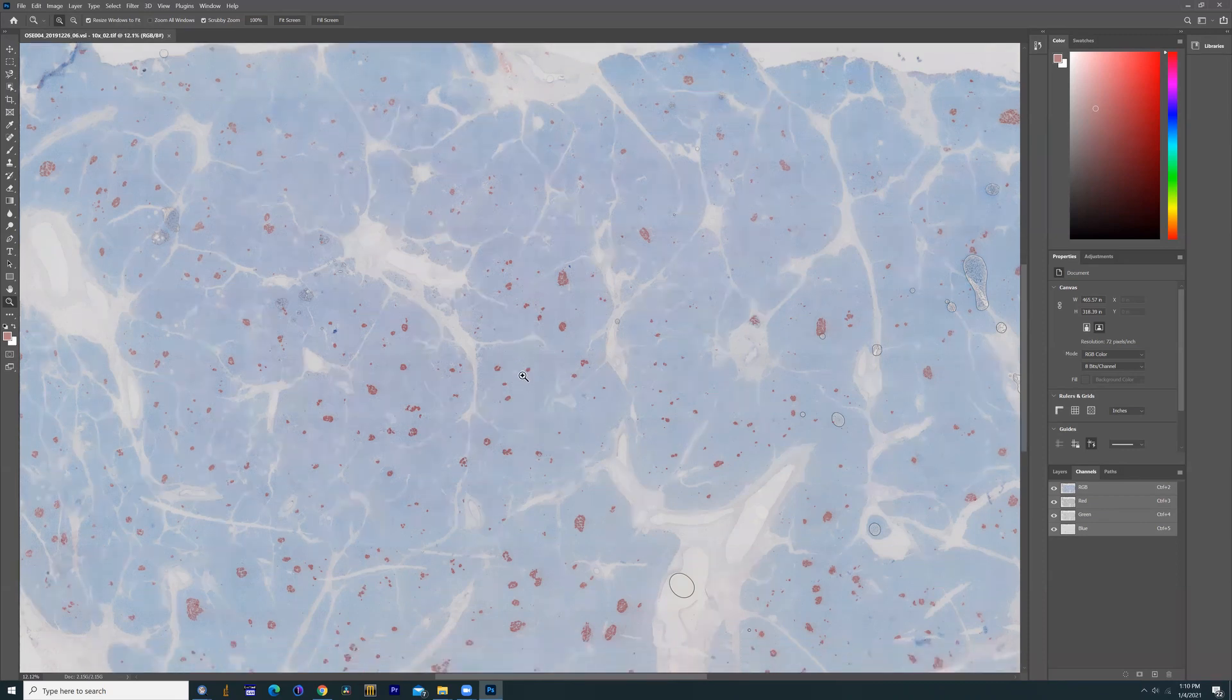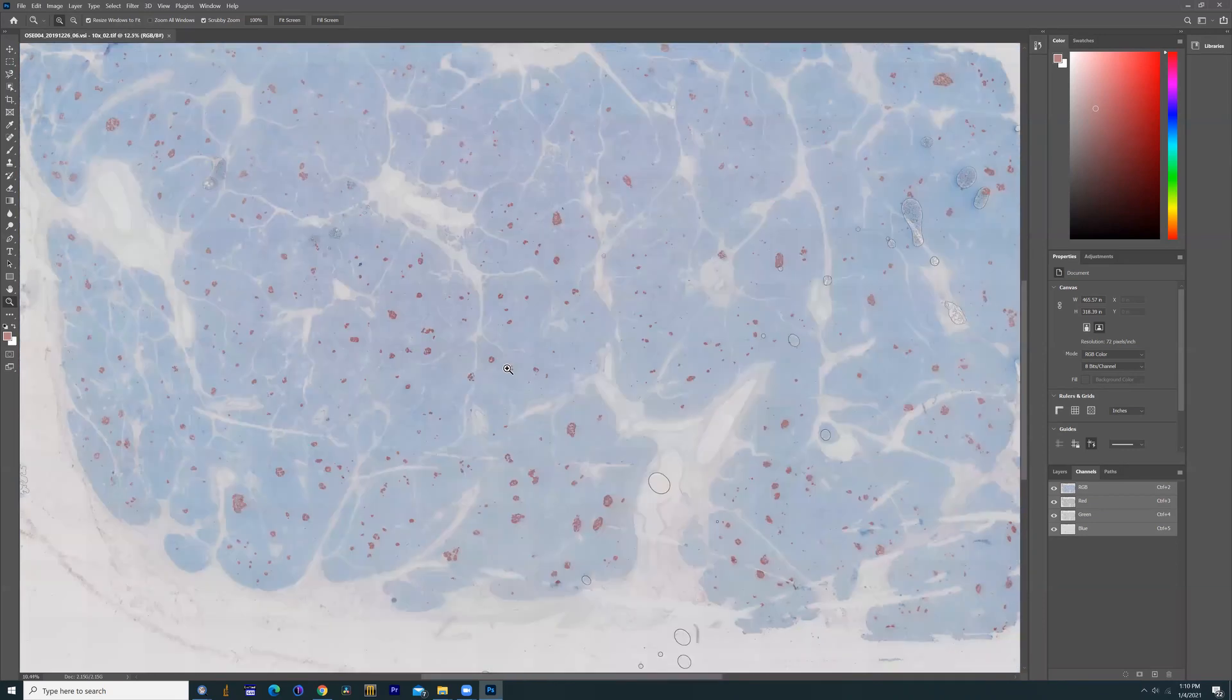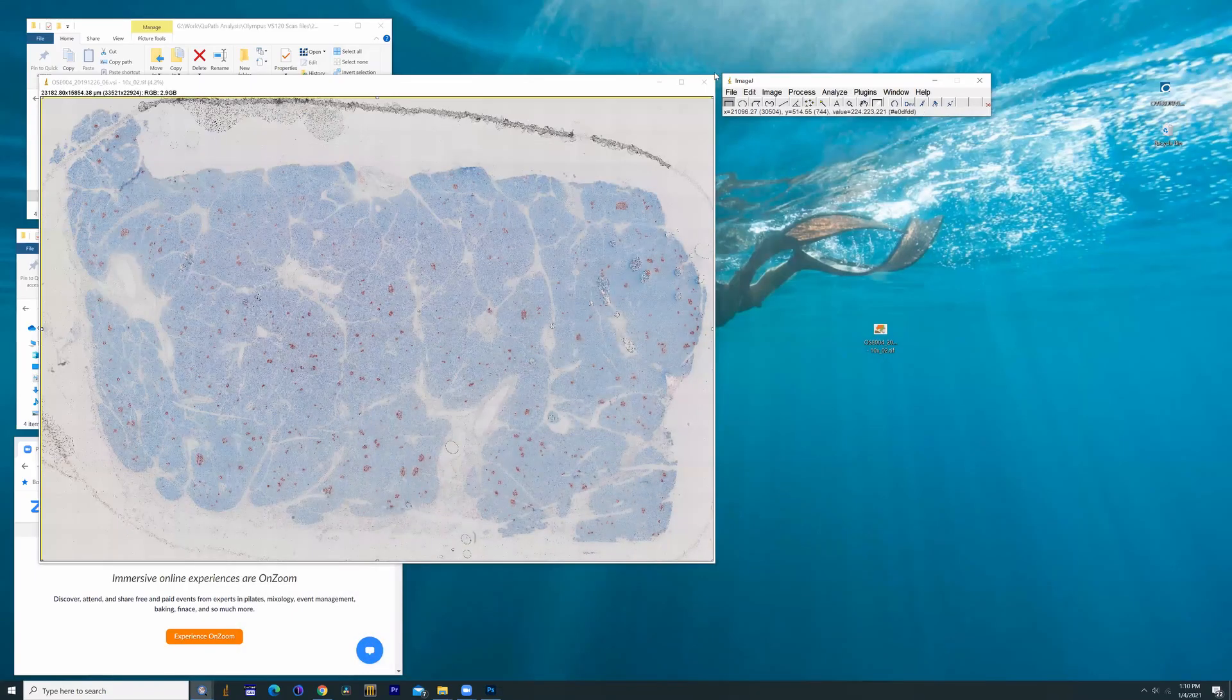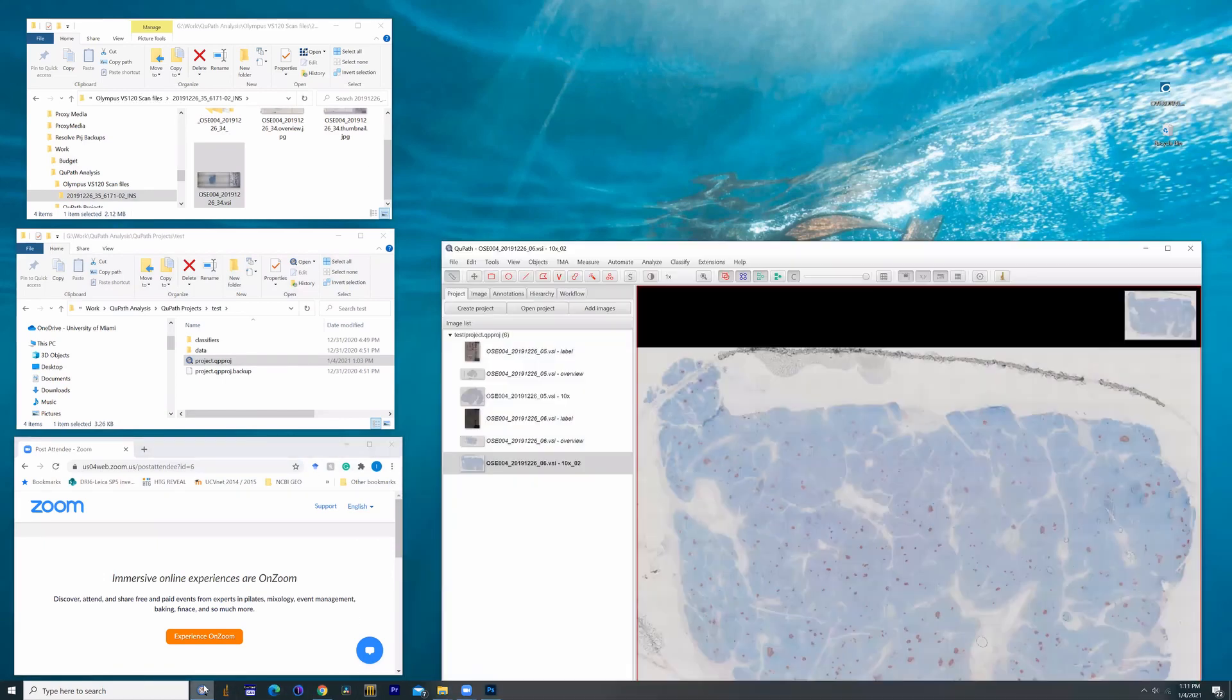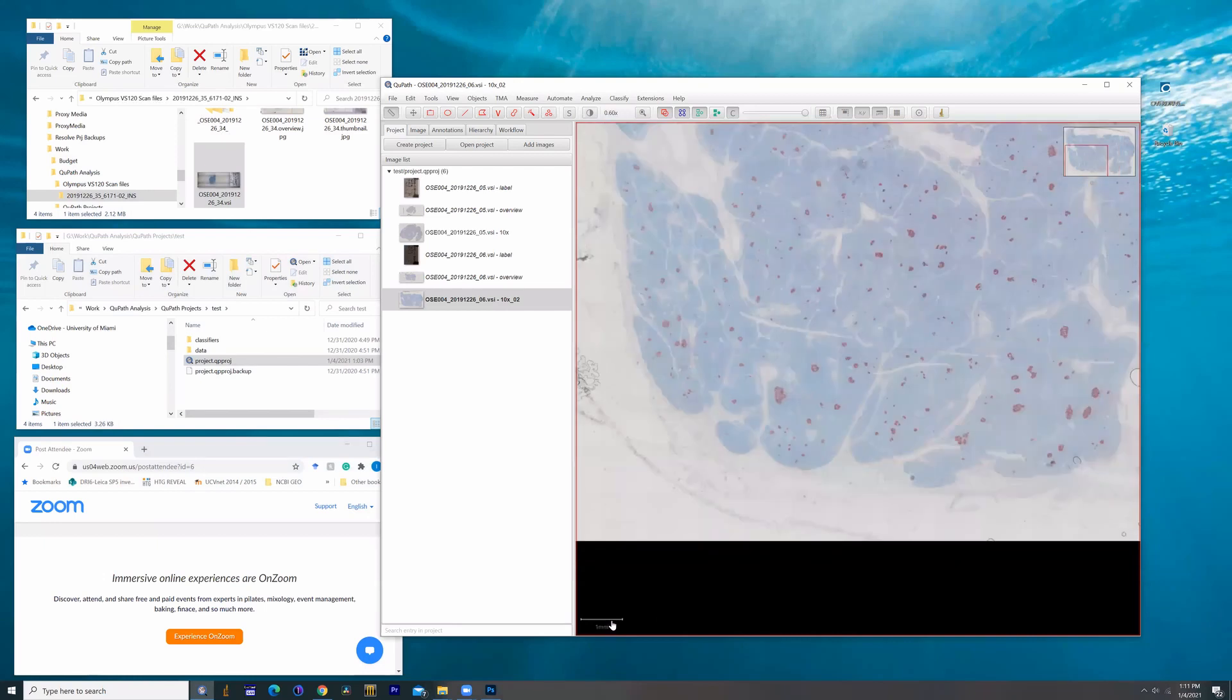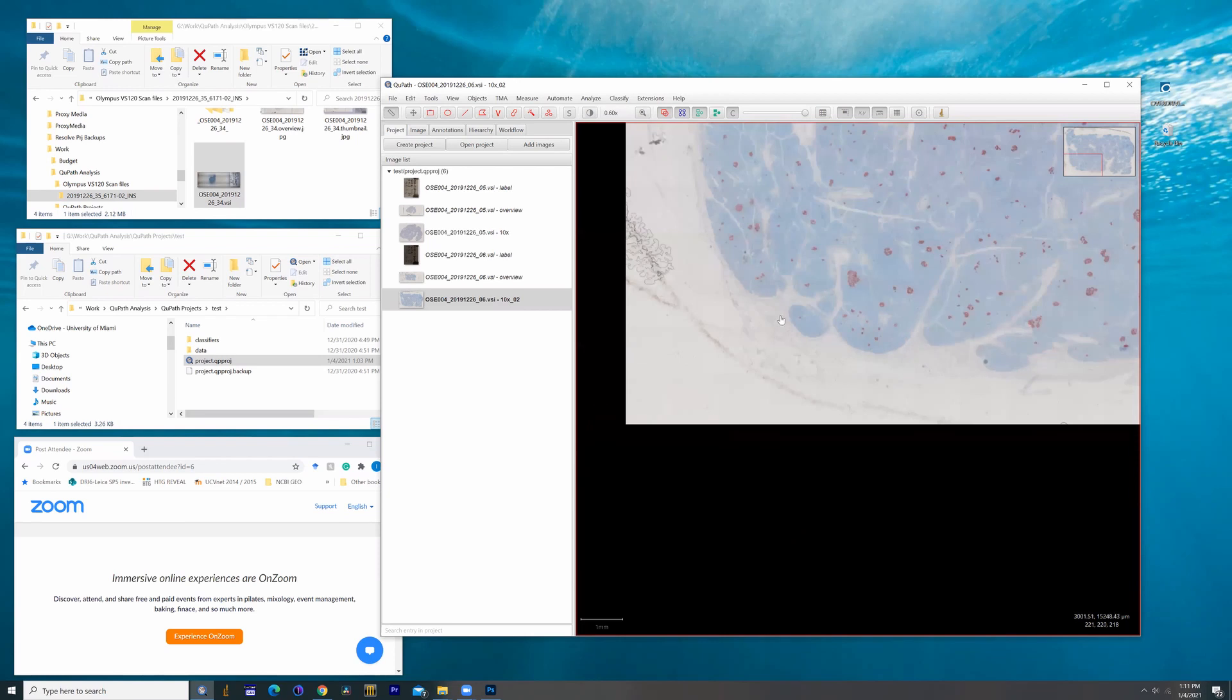Yeah, as you can see, one significant limitation of this file is that we lost the prior scaling data that was available within QPath. So if you want to scale your data, scale size, cell count, that sort of thing, then I would stick with QPath. Otherwise, you're going to have to go through a separate set of protocols to work out scaling.